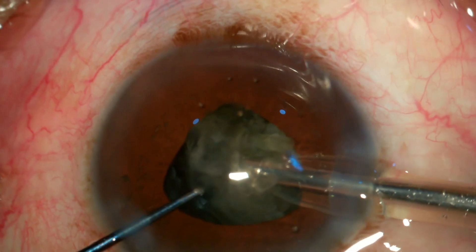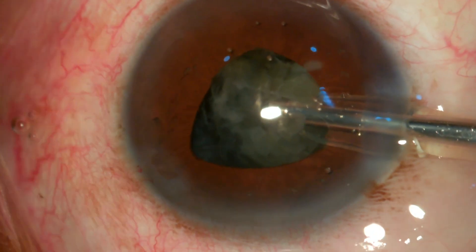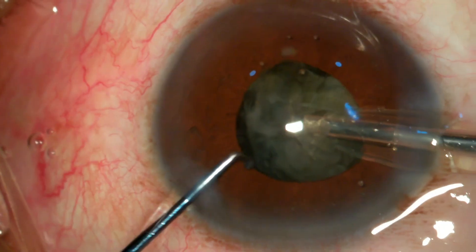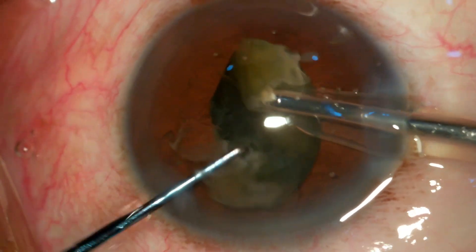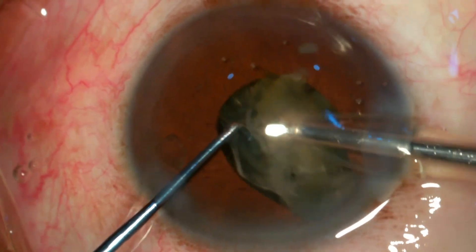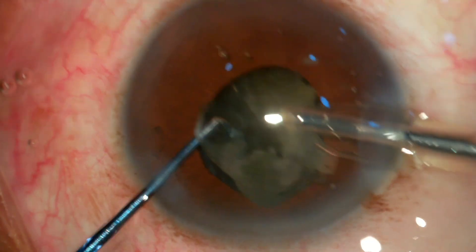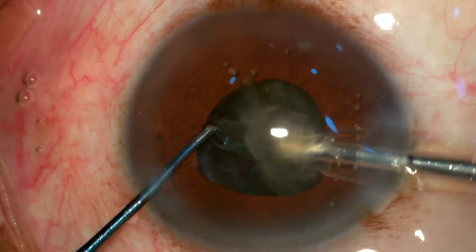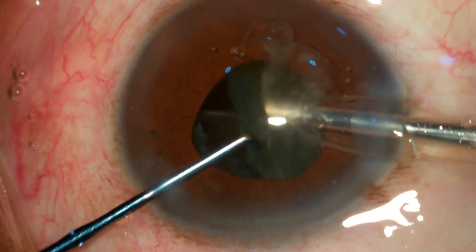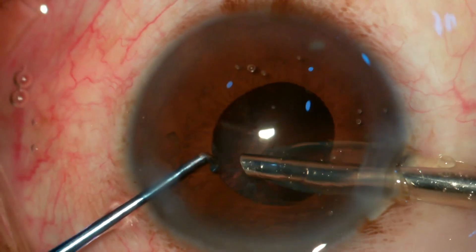I'm mobilizing the other half of the nucleus and chopping it into smaller fragments and emulsifying them. These irises have a tendency to prolapse towards the main port and side port, so any pressure over the posterior lip can lead to iris sphincter damage. We have to be very gentle so that we don't do any tissue damage in these patients.